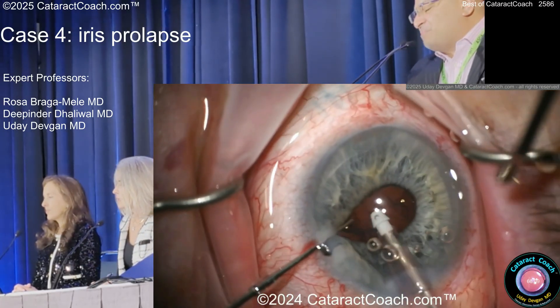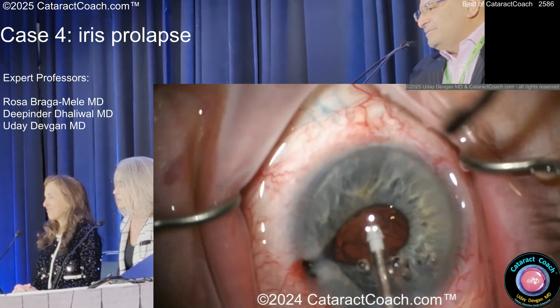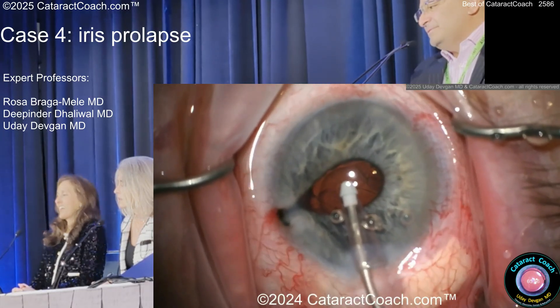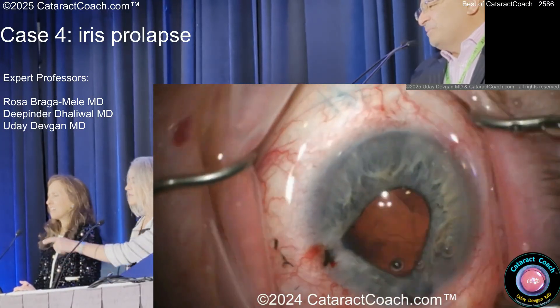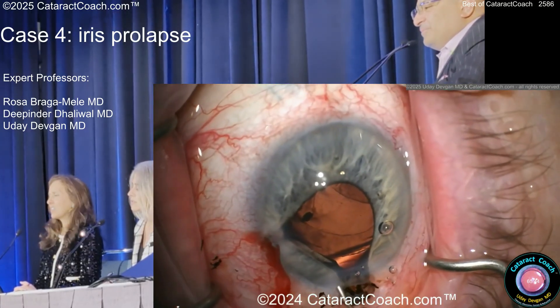Now the pupil's coming down. You notice it's prolapsing out the paracentesis — that's probably a bad sign. What's the pressure in the eye right now? Probably not good. Here's some viscoelastic — oh, there's iris pigment coming out already. That's vitreous. There's vitreous in there for sure, I think.